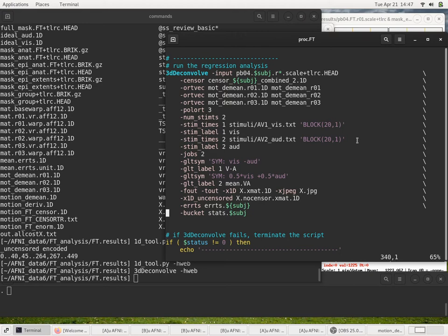So we did a bunch of pre-processing to get the data to a point where we think it is suitable for a regression, and that the output will be, at least to some degree, reasonably comparable across our subjects, and hopefully even across subjects in other studies.